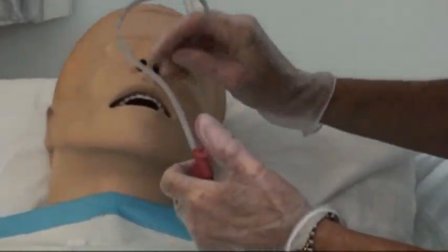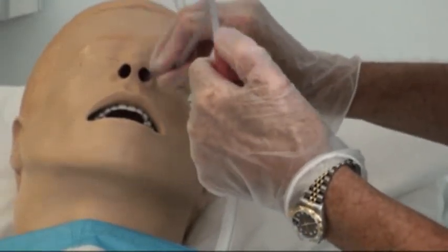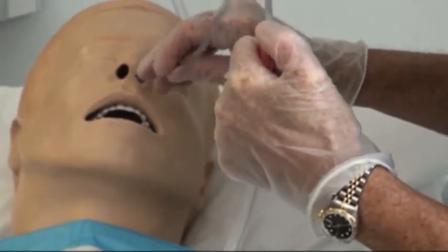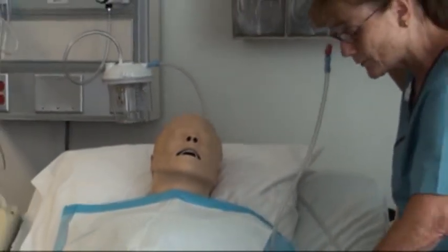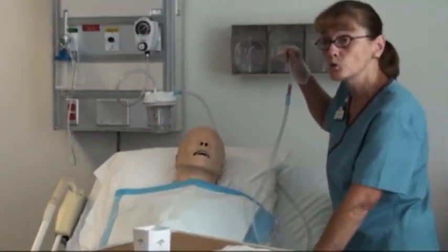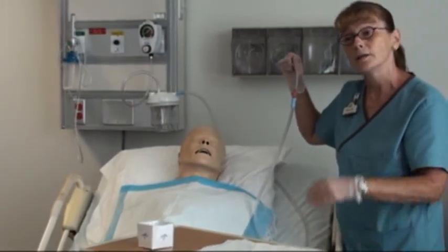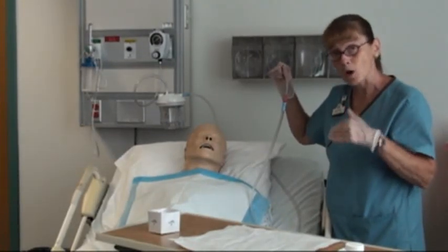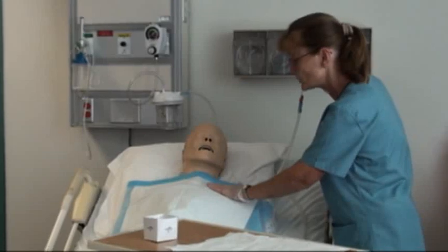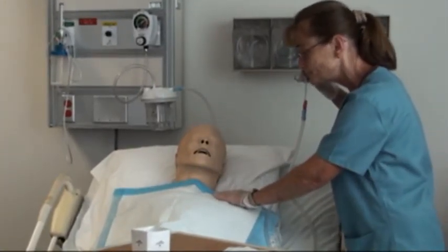So here we go — going down. She's coughing; intermittent suctioning, and I'm twirling as I come out. One of the things you want to be sure of is to keep this sterile. Then take this hand, if you don't have a monitor, to check her pulse — you want to make sure she's fine. Remember, the vagus nerve runs in the back of the throat, and if you stimulate it, it can cause asystole and drop your heart rate. So if she looks like she's doing fine, reassure her, put her oxygen back on if she has oxygen, and keep her calm.